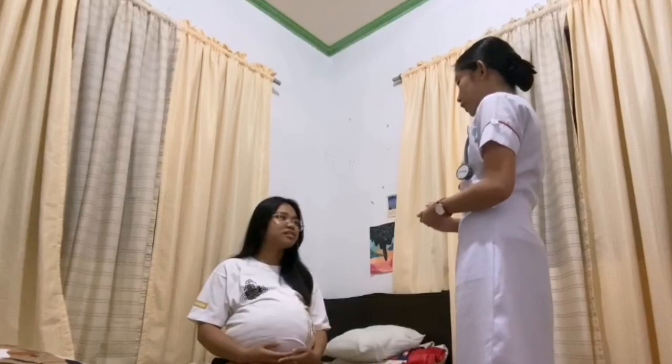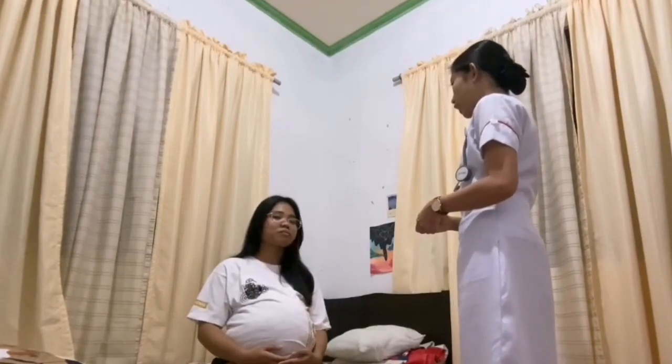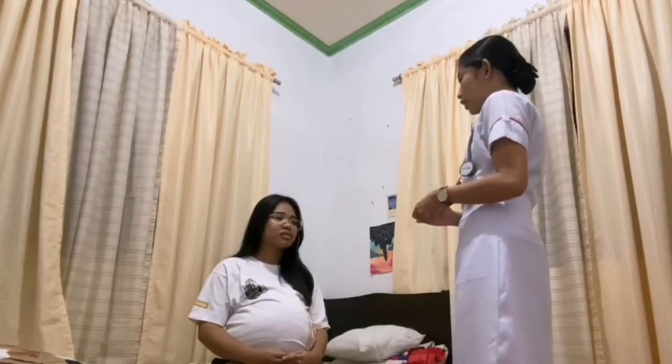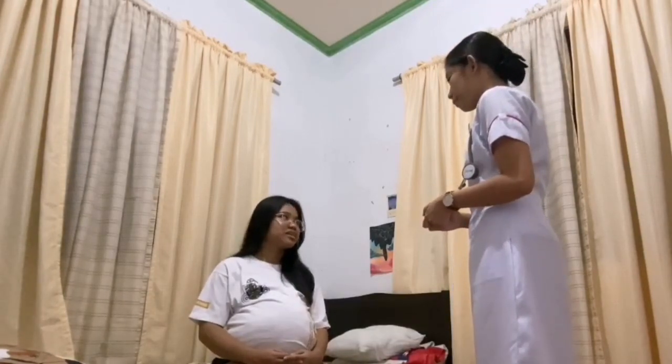Yes. So in this procedure po, we'll be locating the fetus as well as its position, its activity, and its engagement. So see to it that the findings of this assessment will remain confidential between you and me. Is that okay, ma'am? Yes.